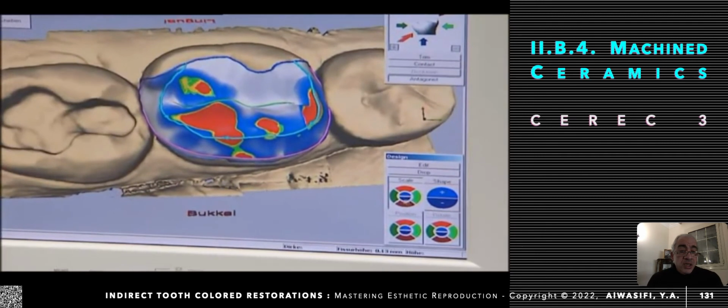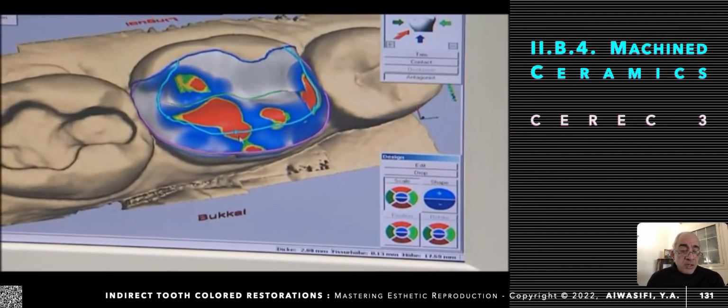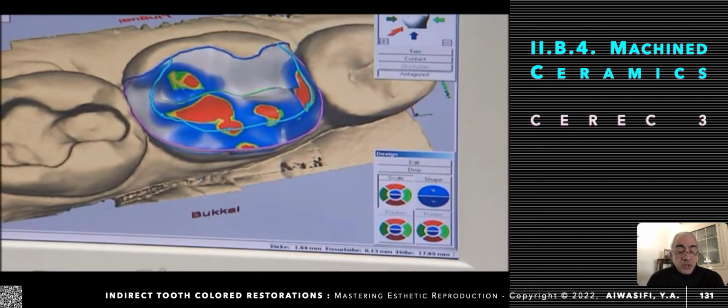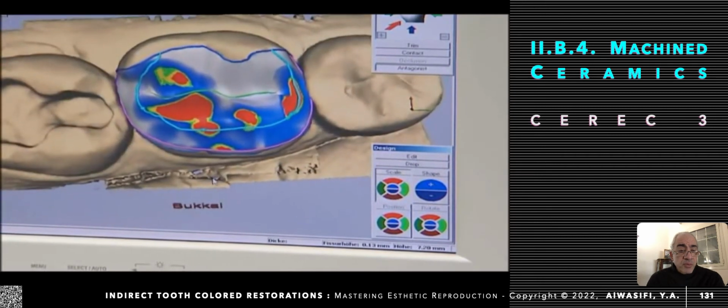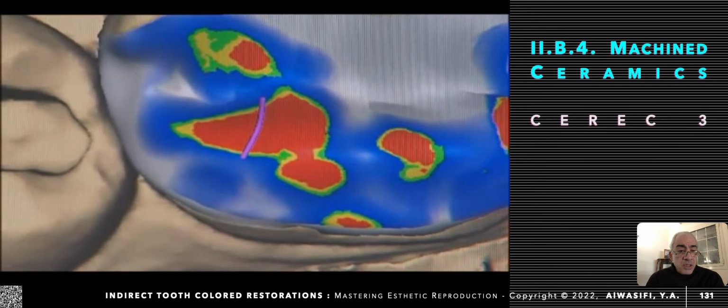Where to build, because when he is adjusting his restoration, now he is checking occlusion and removing the high-pressure premature areas, which are colored red. Okay, each system has its own color scheme, which is illustrated by the window to the side. This pop-up window shows his color scheme.